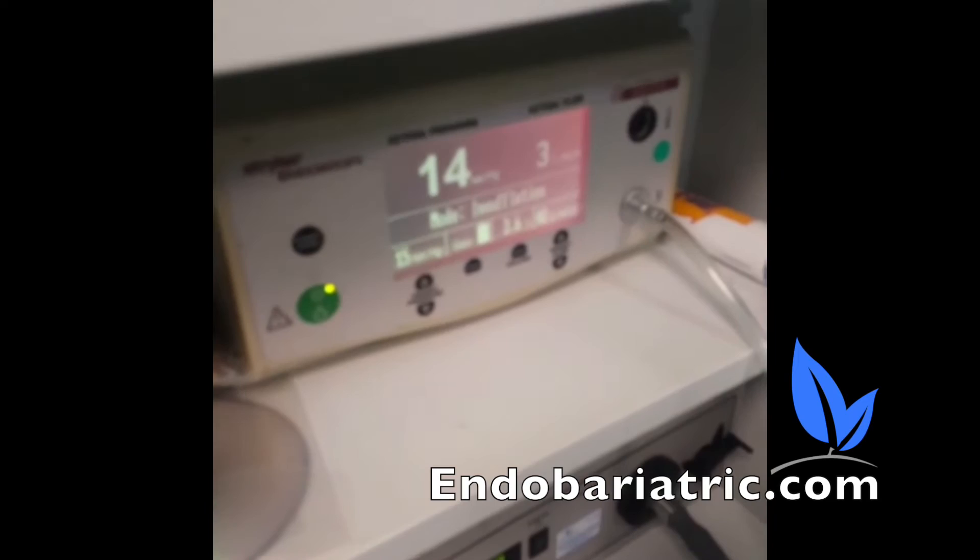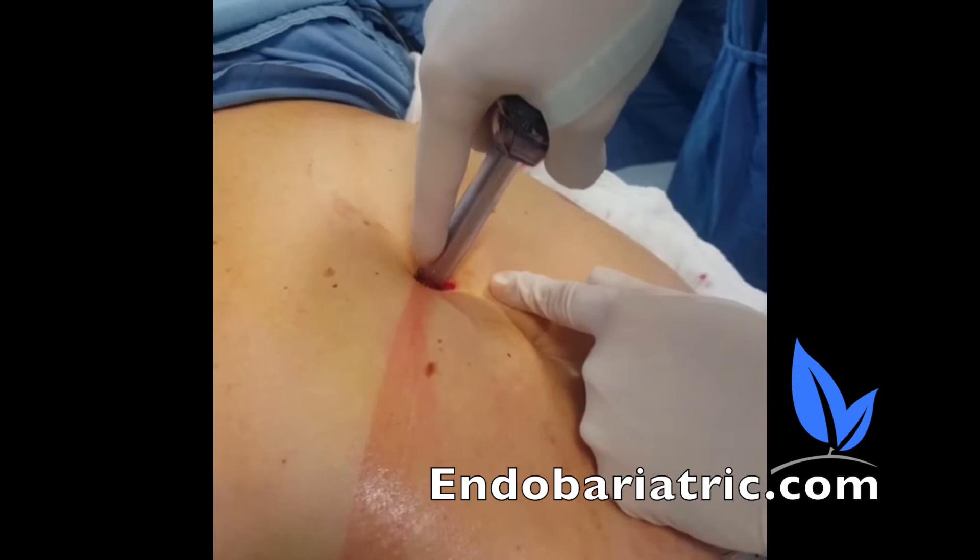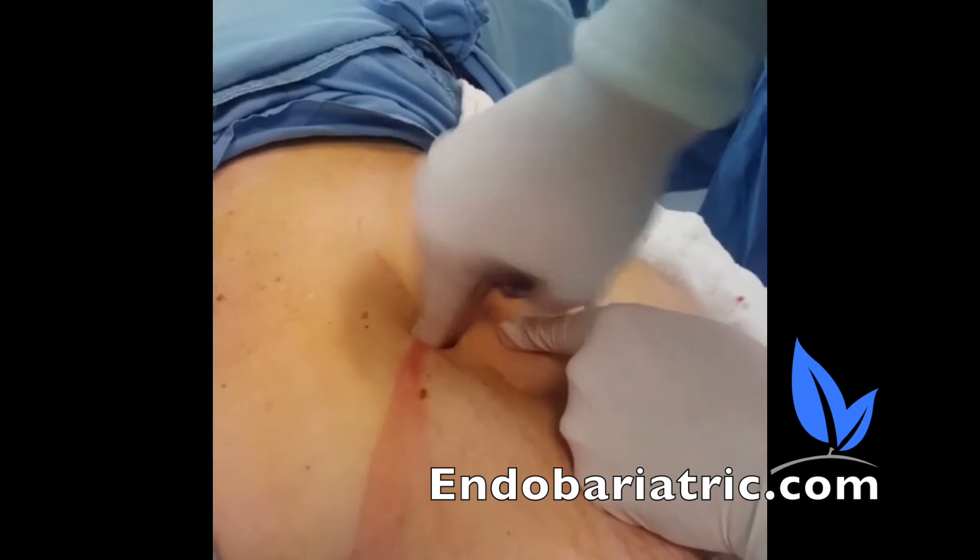After the needle is removed, we go in with the trocar, which goes into the abdomen. It's a blunt trocar that protects the inside. Then the CO2 is attached to the trocar and we can start the surgery.